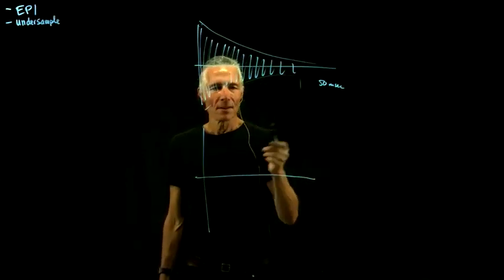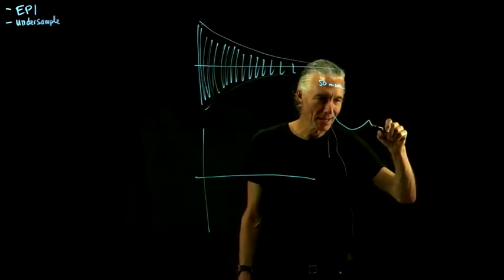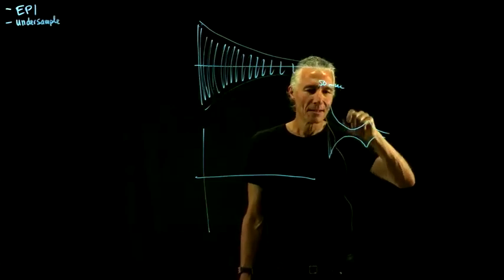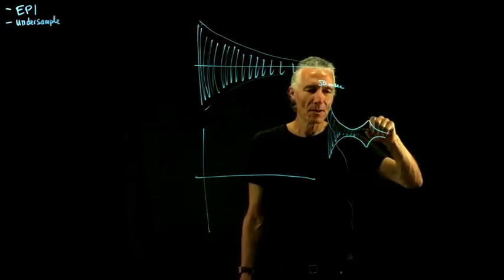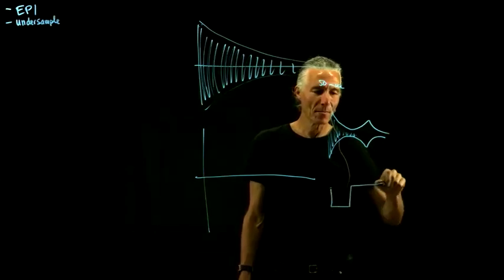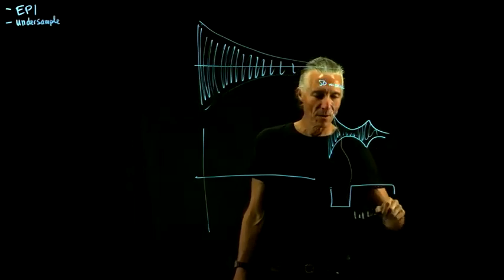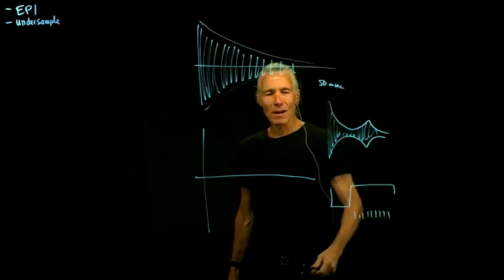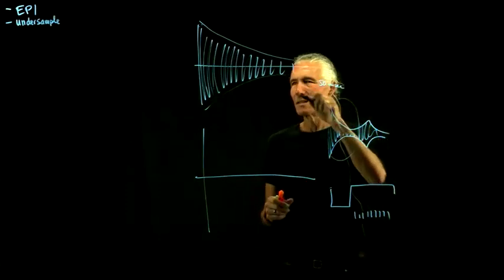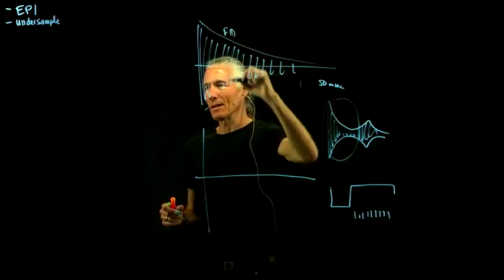Normally I was drawing pictures that look like the FID, and then a gradient echo coming off of it. You do an RF pulse, then turn the gradient on negative, then turn it on positive, and then you get an echo, and you record that echo. Why don't we just jam all of those echoes into a single FID? This is an FID with no gradients on.